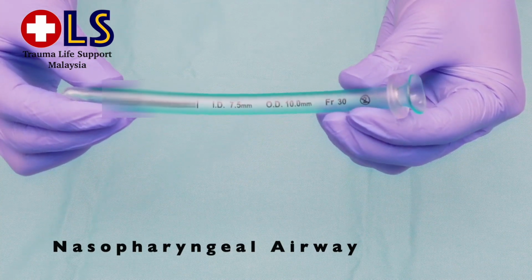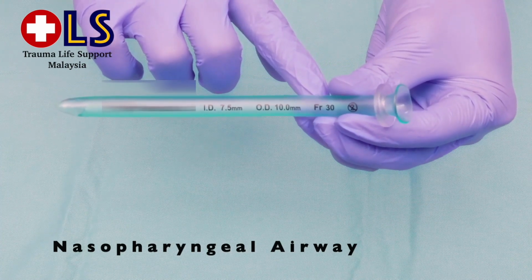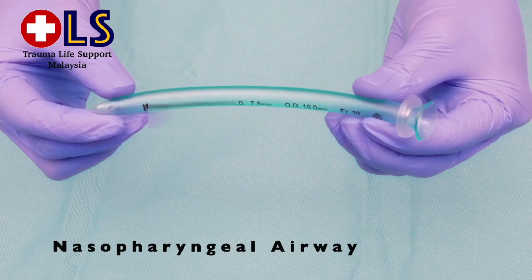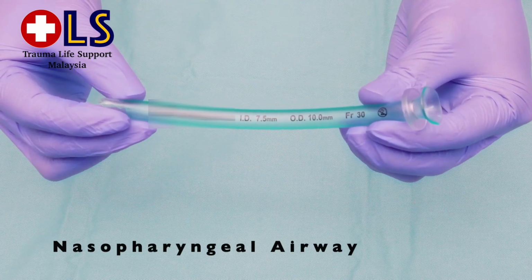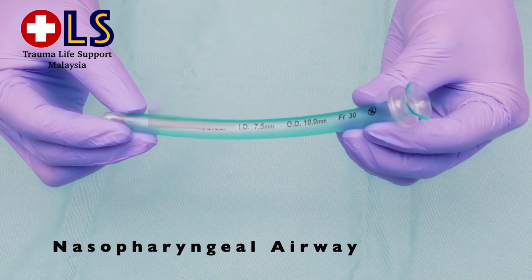NPA comes in various sizes. This NPA needs to be properly measured as the tip of NPA may enter the larynx or into the valleculae, causing coughing, gag reflex, and eventually airway obstruction. If it is too short, it may not be able to separate the base of tongue and soft palate from pharynx.